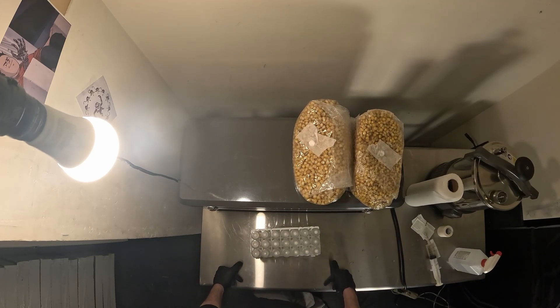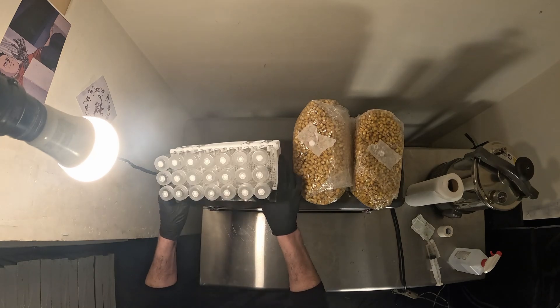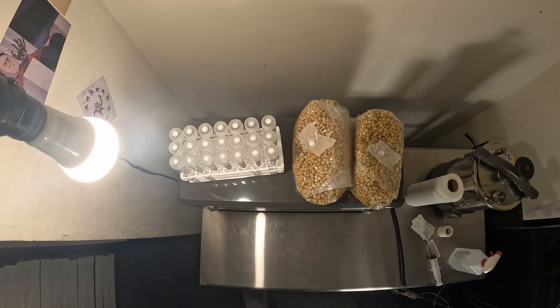The thing is well-built and the stuff was well packaged. If you're serious about pheno hunting plants and you happen to grow mushrooms too, I would definitely recommend it.